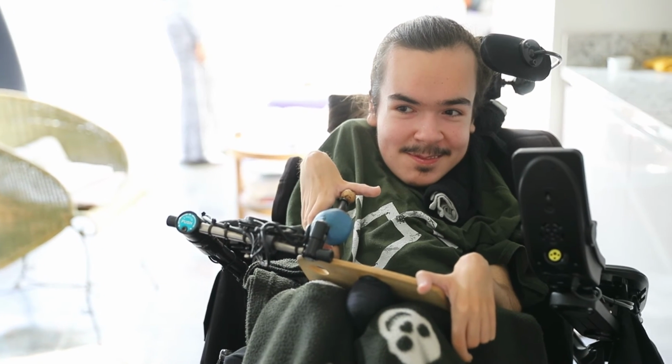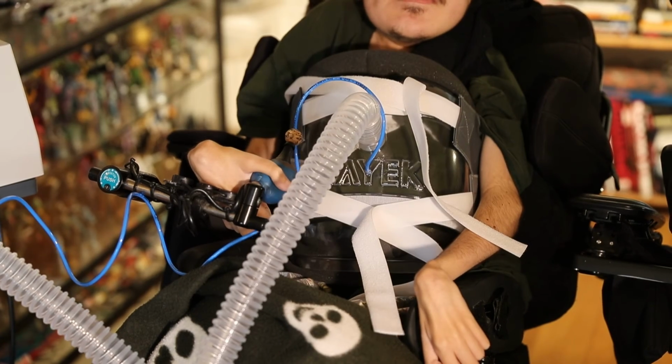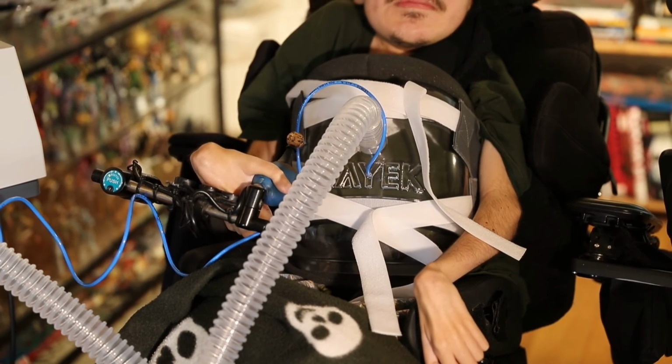And I think sometimes we can forget that actually being intubated is not a very nice experience. RTX works. We need to use that before we go into anything as extreme as a tracheostomy. Some of the psychological impacts of long-term ventilation in intensive cares are well documented. So if we can shorten length of time in any medical setting, I think it's better.